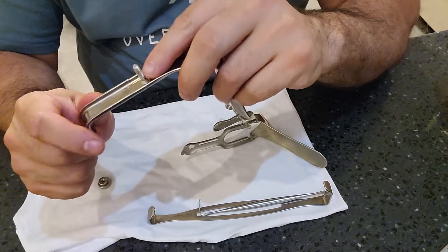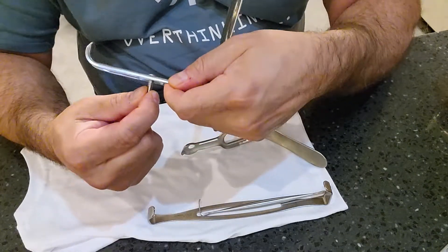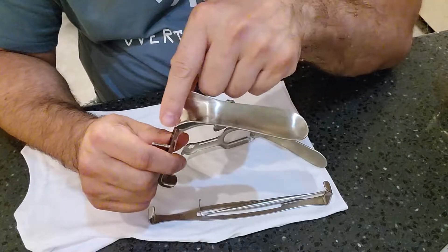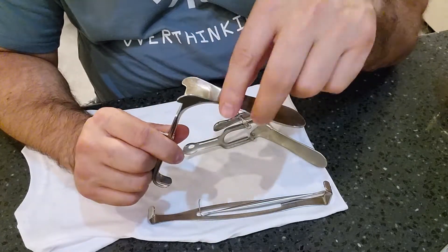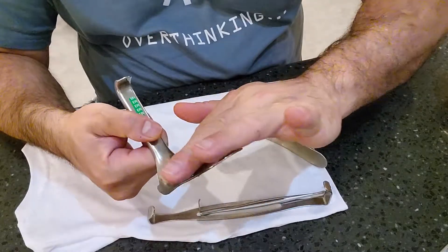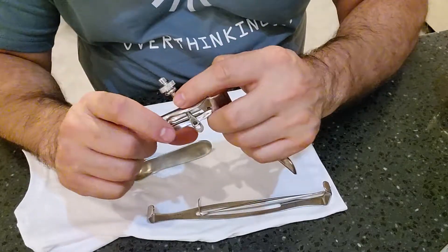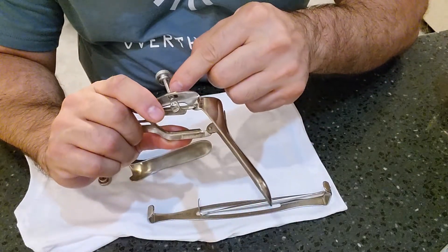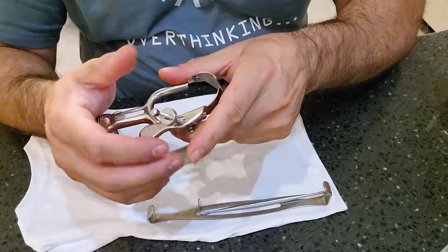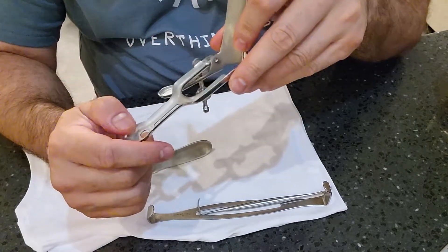Inspect the threading on the screw on the bottom half of the retractor — make sure it's firm and not loose, with no bio burden. Check the track area where fluid is designed to flow down, ensuring no bio burden or debris. The serrated threaded screw should thread correctly, and the nut attached should move freely back and forth with no debris.